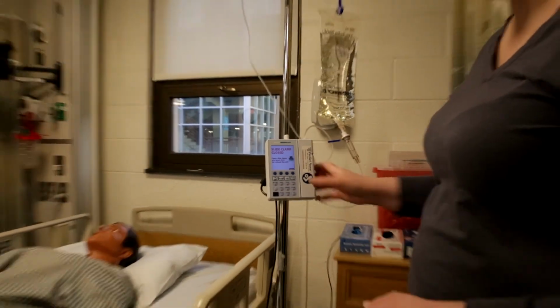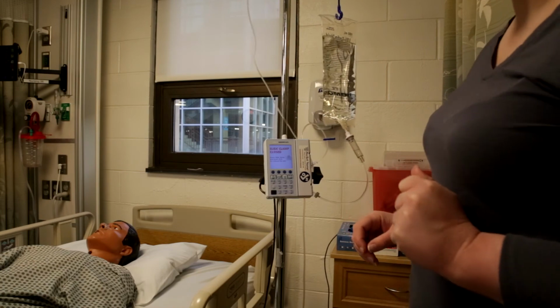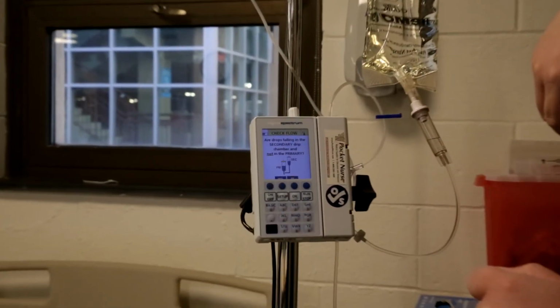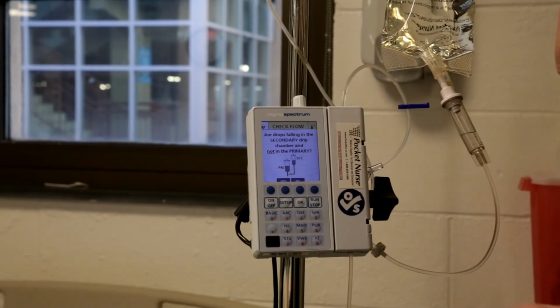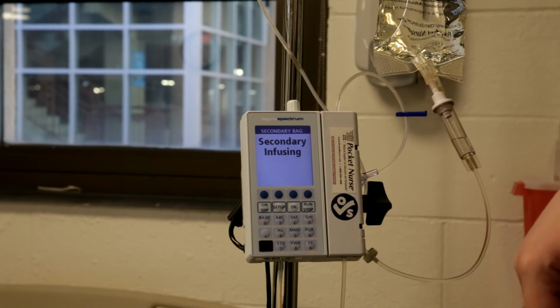We're going to undo all our clamps and push run. And we have drops flowing. I saw one. Yeah, it's going. So we're going to hit yes, and that's it.